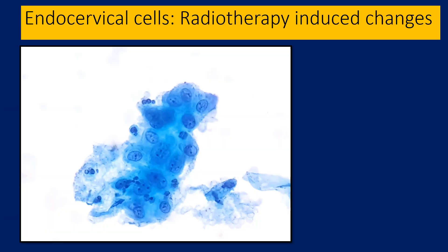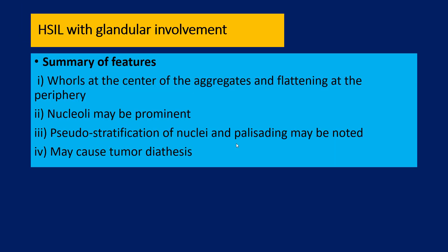Endocervical cells following repair into radiotherapy can look pretty nasty. As in this case, there is enlargement of the nucleus and the cytoplasm at the same time, with very prominent nucleoli, and they look pretty ugly. But once you know that there is a history of ionizing radiation, you can attribute the changes to the therapy and not to any epithelial abnormality.